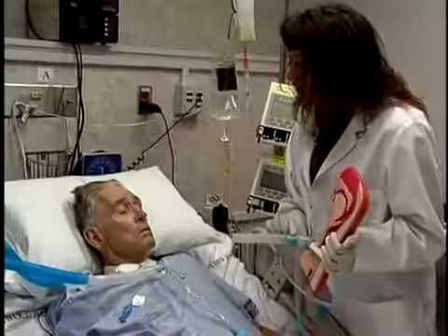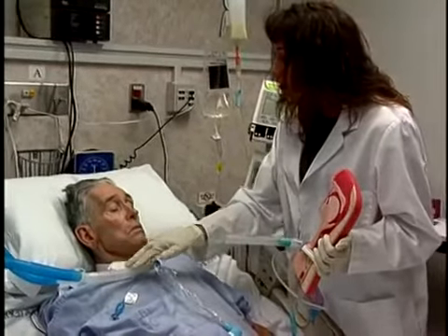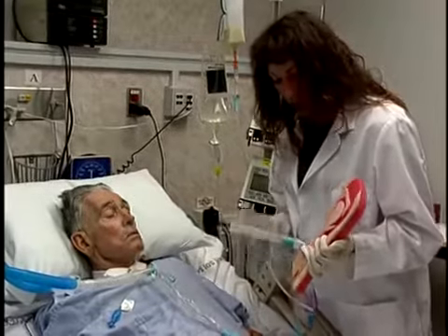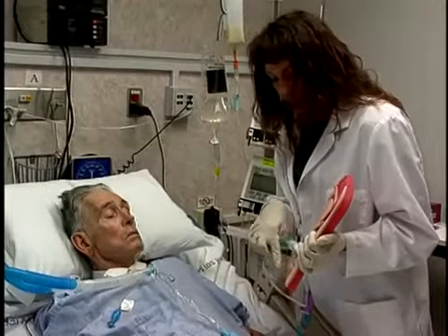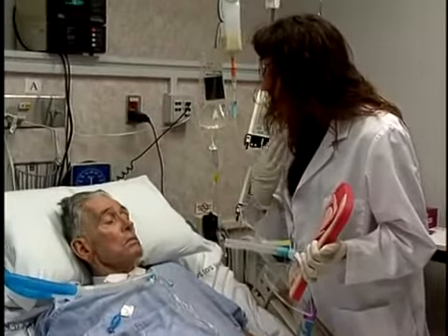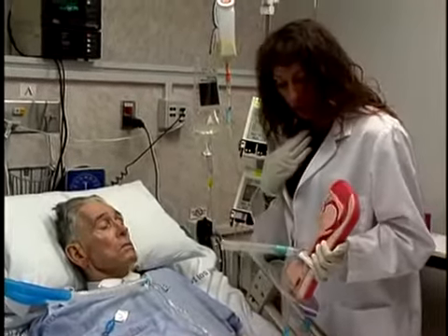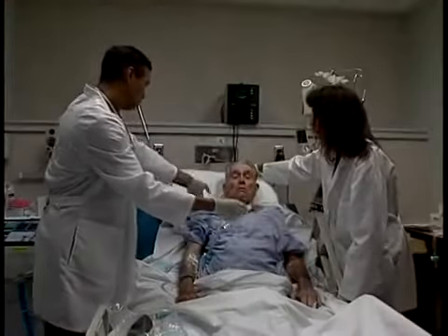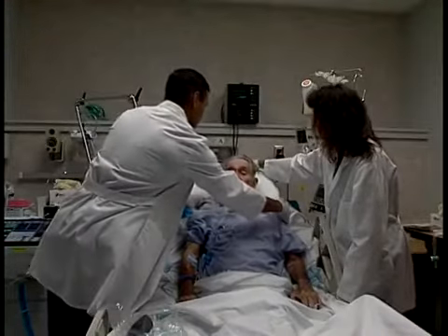Educate the patient to the use of the Passy-Muir valve, letting them know beforehand what to expect when airflow is redirected past their vocal cords. This is especially important for the ventilator-dependent patient, as there is oftentimes a higher level of anxiety related to ventilator and tracheostomy tube issues. Position the patient comfortably for optimal airway patency.